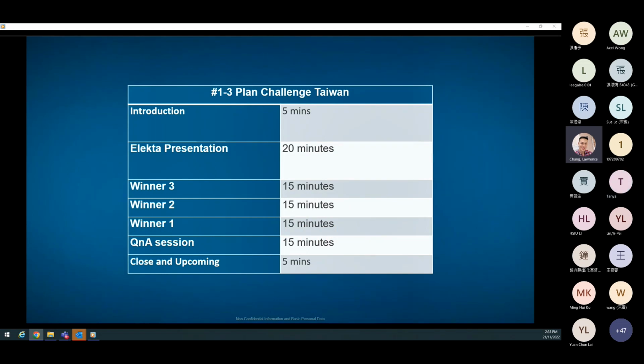So what we're having today is the introduction, and what we're doing is introducing you to a few of the members of the team. We're also introducing you to new features within our treatment planning system, and also introducing this Monaco Academy. And what we're doing is really setting up 3 separate plan challenges that are quite fun over the next couple of months.